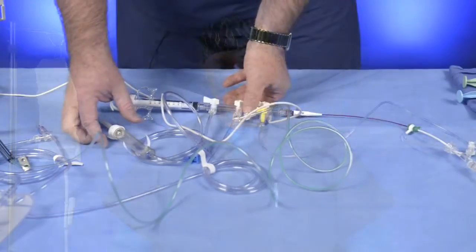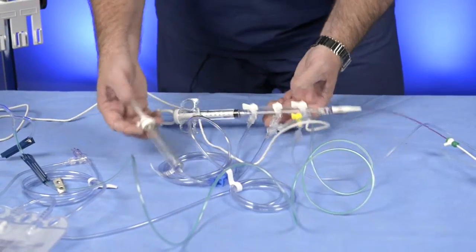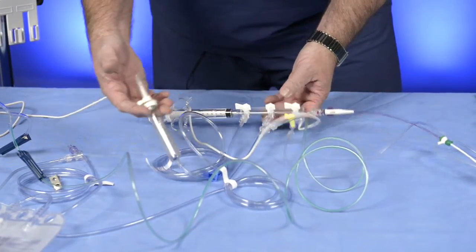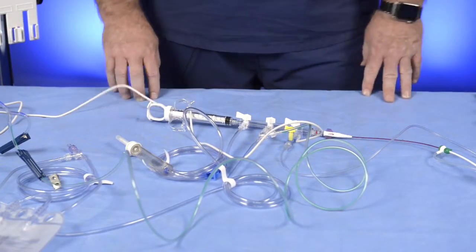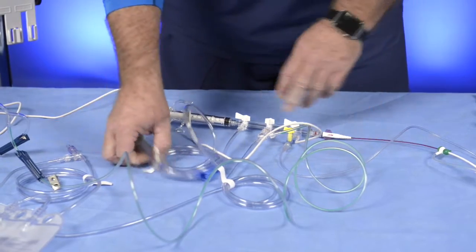Today we're going to take you through the Trampi setup. I've opened everything up and set it out on the table sterilely. I've handed all the devices off to the circulator, to the scrub, whoever's in the position of helping you out. This is the kit itself, the Trampi kit — this is what was in the bag. We laid it out on the table here. Obviously this is going to be sterile and you're going to start handing off pieces of the kit as we go.